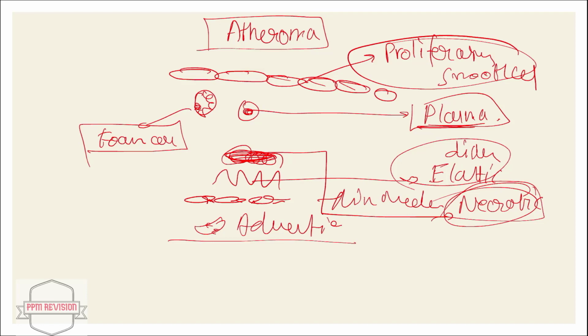The deeper the atheromatous plaque, the fibrous tissue has lost all its structure and is swollen, hyalinized and fragmentized, and a few empty elongated needle-like spaces suggest the cholesterol crystals are present. The adventitial coat and the vasa vasorum are normal. So here, the important point is what is normal.